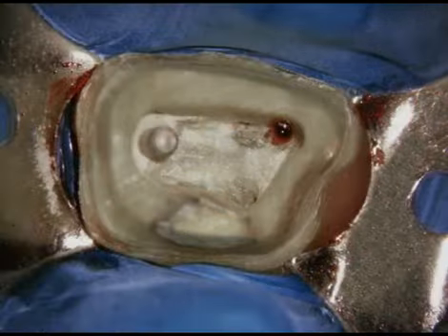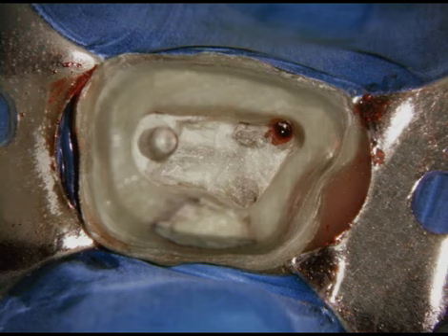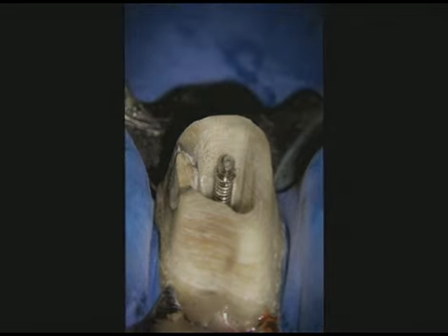Here we can visualize straight line access to the fully exposed post, bleeding from the MB1 orifice and evidence of an MB2 orifice system. In this case, I utilized the post removal system. A selected trephine precisely machines the coronal 2 to 3 millimeters of the post. The head of the post is perfectly round and can be tapped.